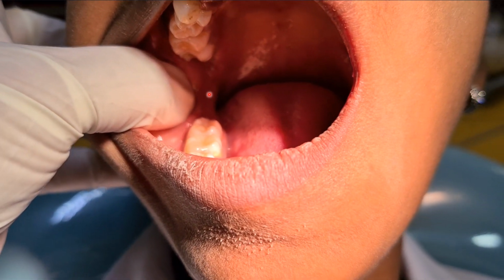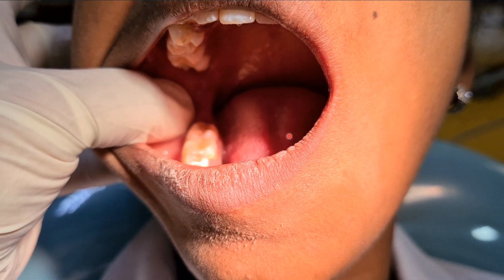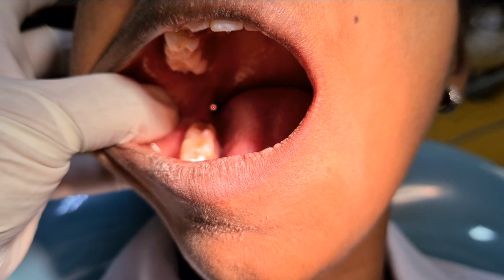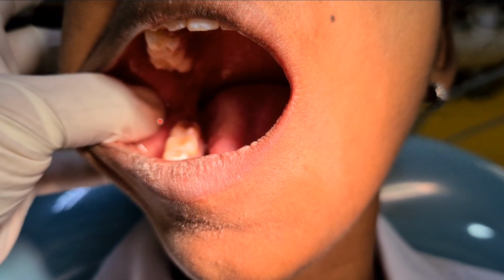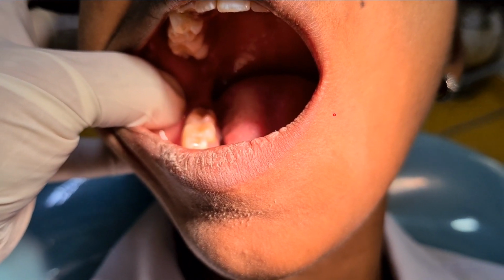We first ask the patient to open their mouth wide. We feel for the anterior border of the ramus and the external oblique ridge, and then place our finger on the coronoid notch, retract all the tissues from the internal oblique ridge outwards, and identify the pterygomandibular depression with the patient's mouth wide open.